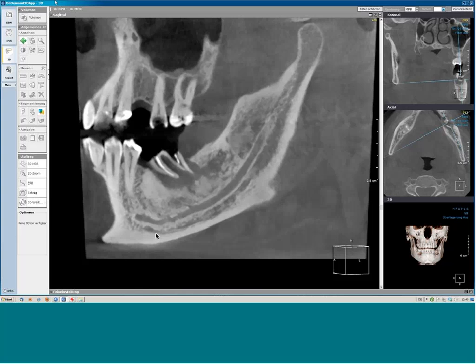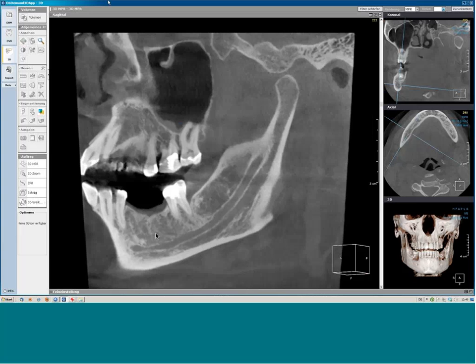Sclerotic bone changes are only a sign of the impact of more minerals into the bony pattern as a reaction to, let's say, this inflammation. Okay? So reactive sclerosis, very typical in case of any kind of periapical or periodontal bone changes. Here you can see as well periodontal bone change and a very small reactive bone pattern.